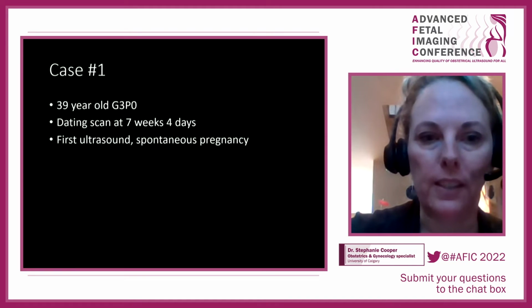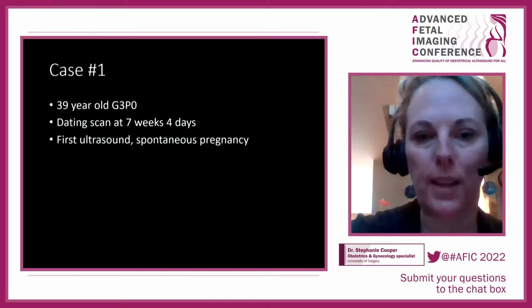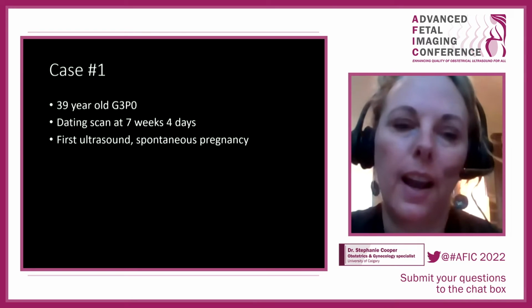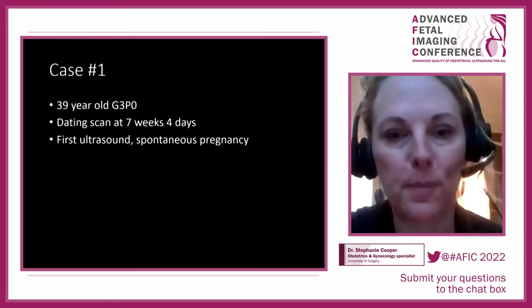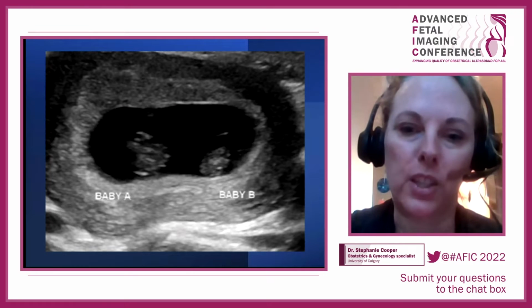So here's a case, 39 years old. She is having a dating scan at 7 weeks and 4 days. This is her first ultrasound and a spontaneous pregnancy. And this is a patient of mine. When I give these cases, I'm usually giving you examples of my own patients. They're not just random images. These are people with stories attached to their images.